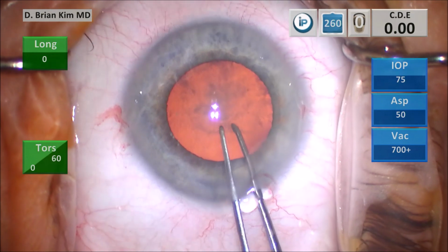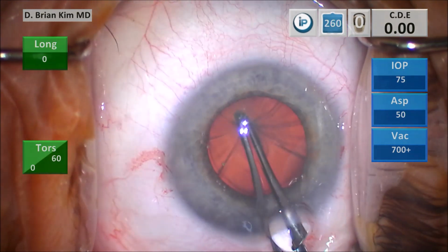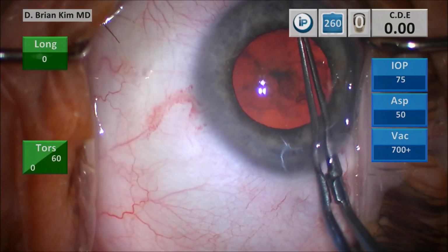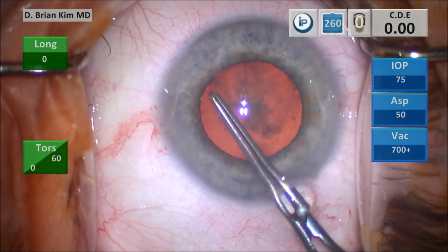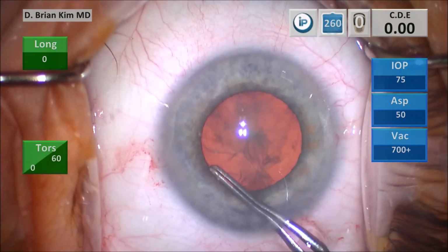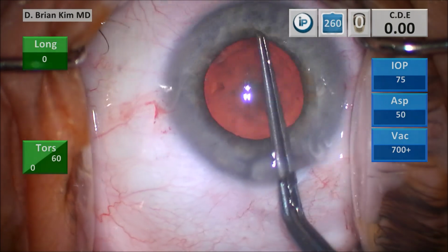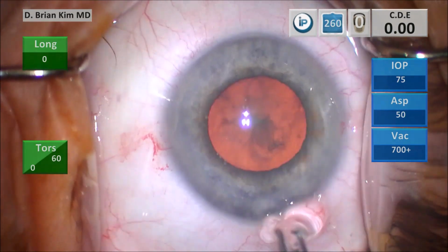Doing my puncture style capsulorhexis, puncturing with the forceps, pulling downward, and then creating a little bit of a flap towards the right, grasping the flap, trying to use the corneal mark to help guide the size and centration of my rhexis. I'm grabbing and re-grabbing. And then I'm finishing off the rhexis, and then I'm going to burp some viscoelastic, which will help for the hydrodissection.